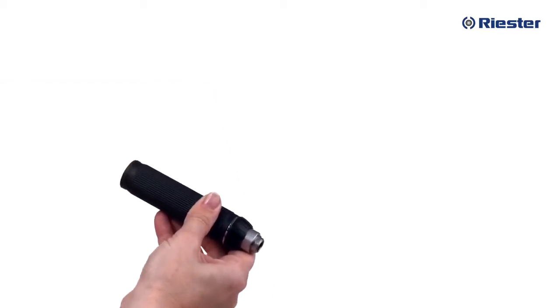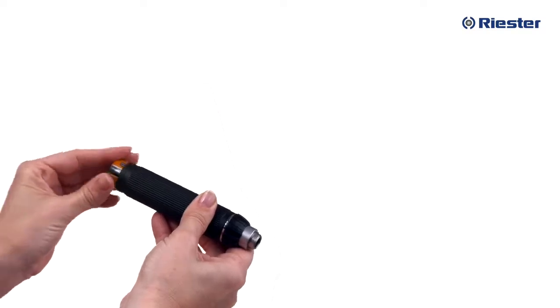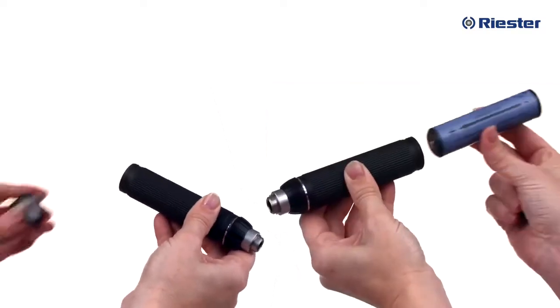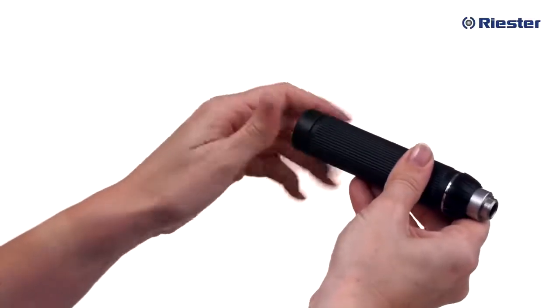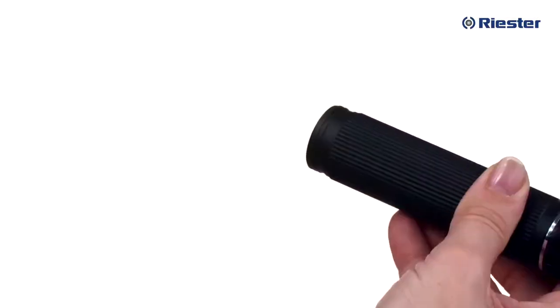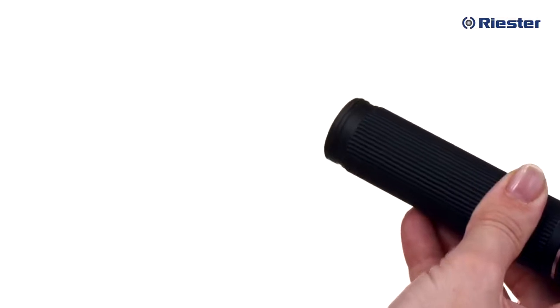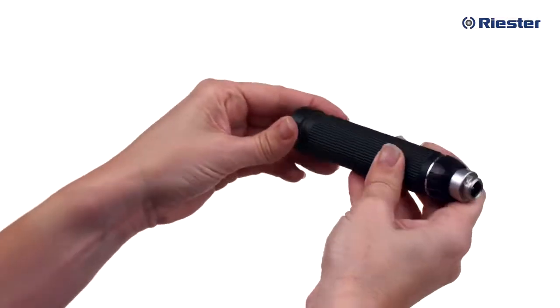Riester RiScope otoscope and ophthalmoscope sets will run on either two size C alkaline batteries or a single rechargeable lithium ion battery, depending on the set you purchased. To insert or replace the batteries, simply turn the handle upside down and unscrew the cap. Place the batteries inside the handle with the positive end going in first and screw the cap back onto the handle.